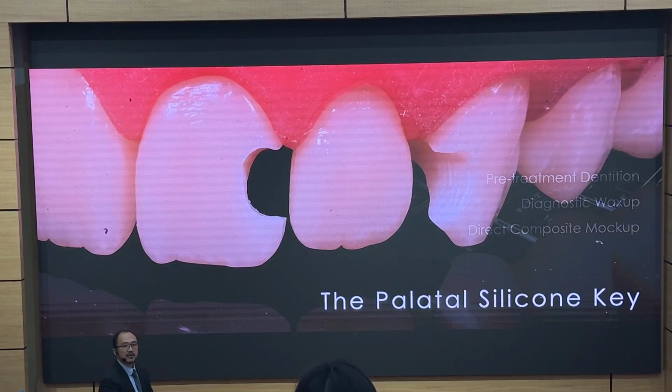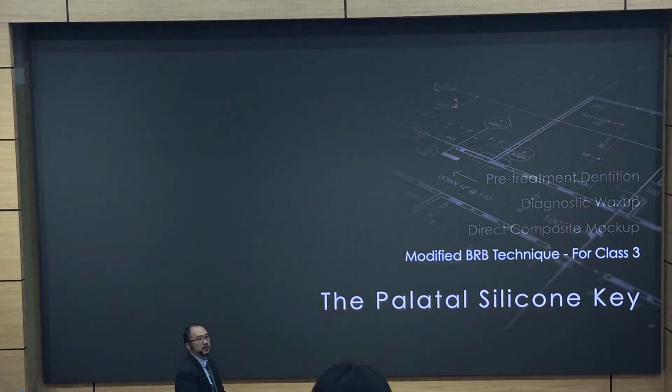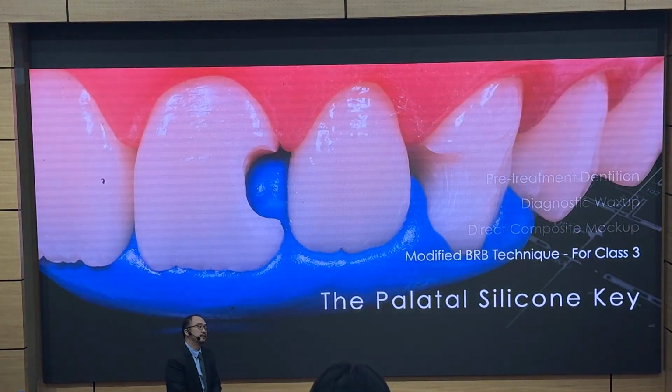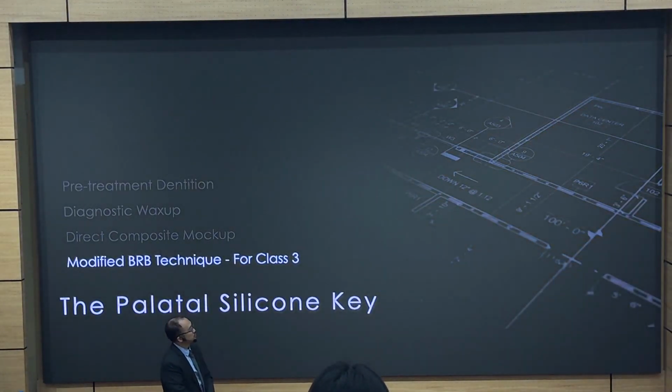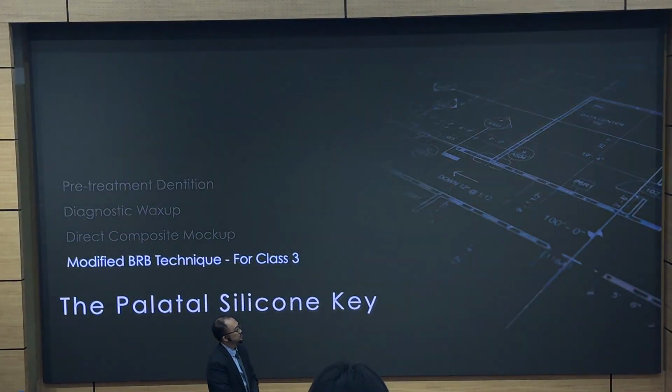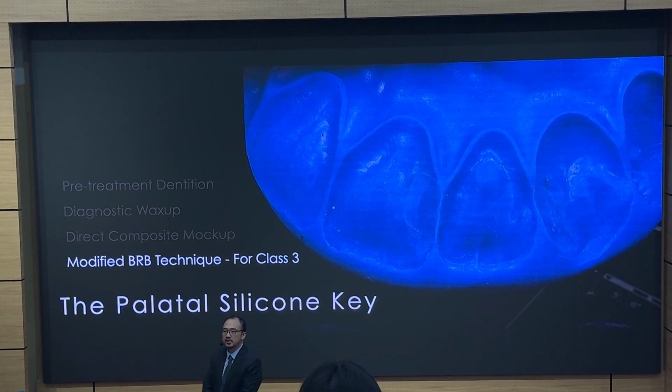When you have something like this, I do the same thing. I do a small piece of putty. Then I just grind out the defects. I put it back in the patient's mouth. It makes my class 3s a lot faster. Alright? Because I don't need to worry about excess management. I don't need to spend too much time on removals.